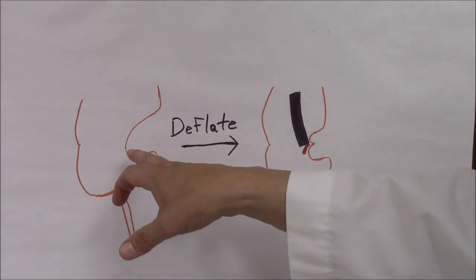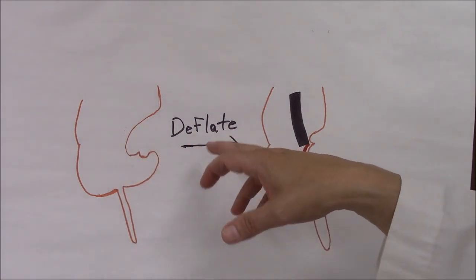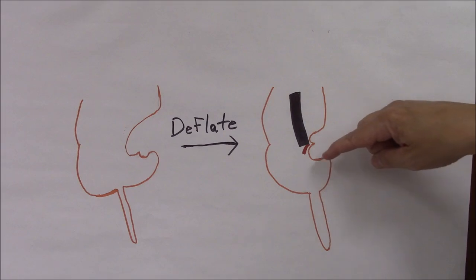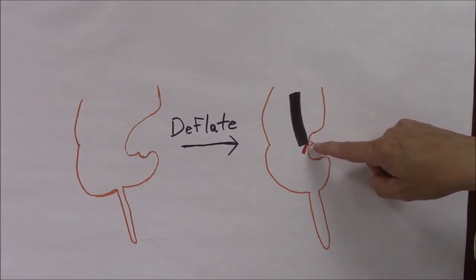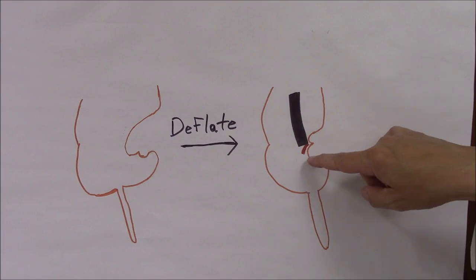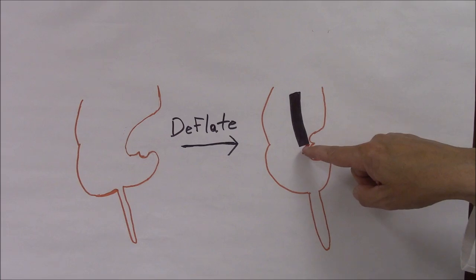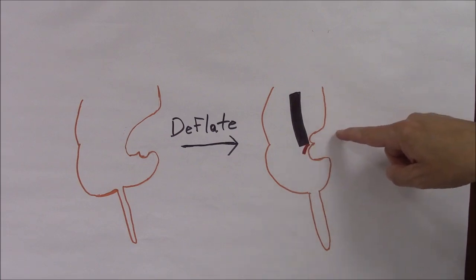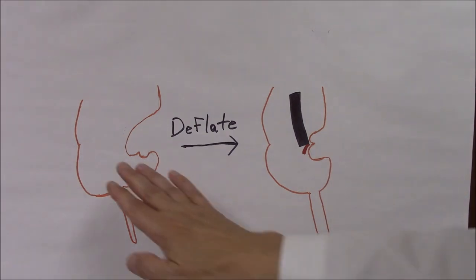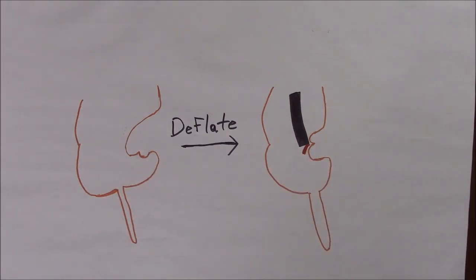If you don't see the actual space between the valve lips, simply deflate, because deflation will tend to turn the valve up so that it's facing more anally. The key thing is to just see that crack between the valve lips. The proximal or cecal side lip is what you want to visualize, and then just drive up and aim the scope into the crevice in between and deflect into the terminal ileum. This is by far the fastest way to get into the terminal ileum on a routine basis.